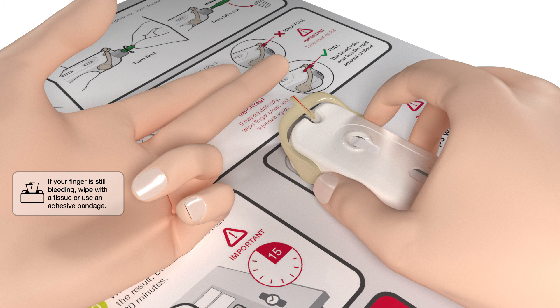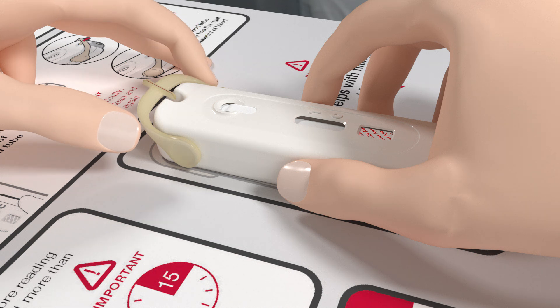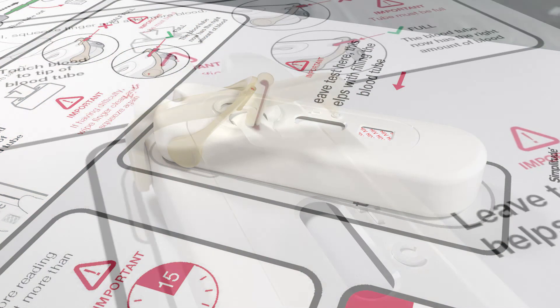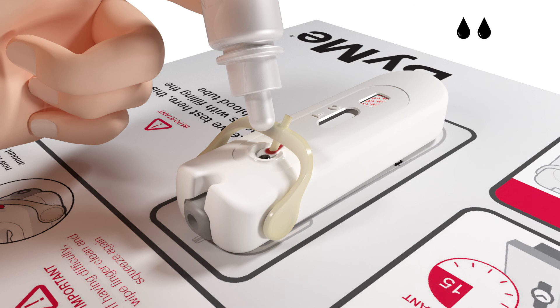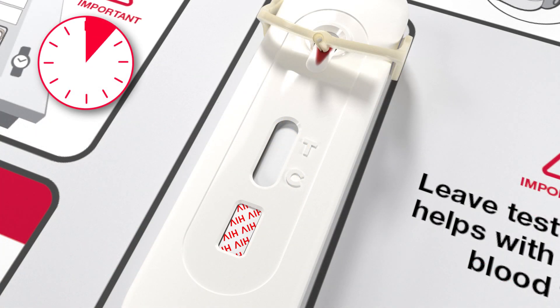This will ensure the test has the correct amount of blood. Once the tube is filled with your blood, hold the test on the table and flip the blood tube over to the well until you hear a click. Check to make sure the blood has moved from the tube into the well. Then add four drops of the test fluid into the well. Start your timer and wait 15 minutes before you read the result.